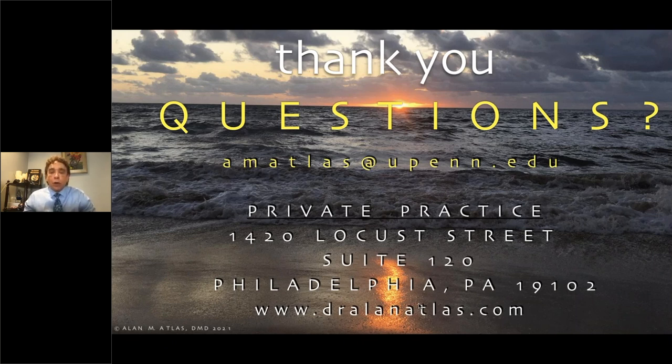You're not going to get a good outcome cementing a crown with glass ionomer or doing a post with a glass ionomer, and especially doing a post or core buildup with a glass ionomer or resin modified glass ionomer. Please stay away from those materials when doing those types of procedures. Use core materials as your go-to. If you want to put a post in with a cement, self-adhesive cement, resin cement, that's fine. But you're still going to need to bond the coronal aspect. So you're doing two different procedures, and you're not creating the true monoblock.